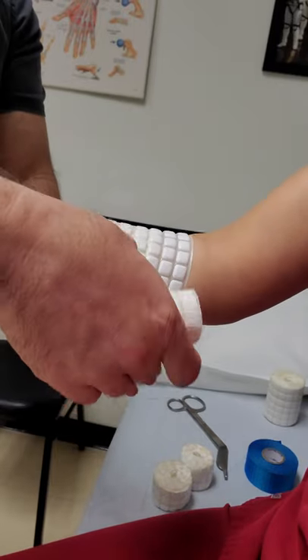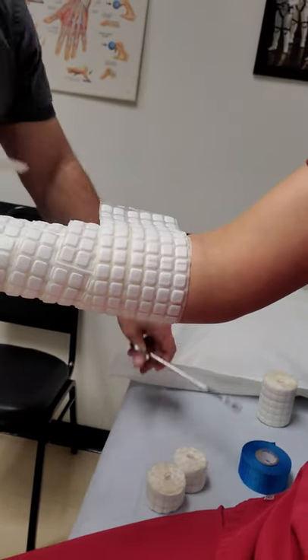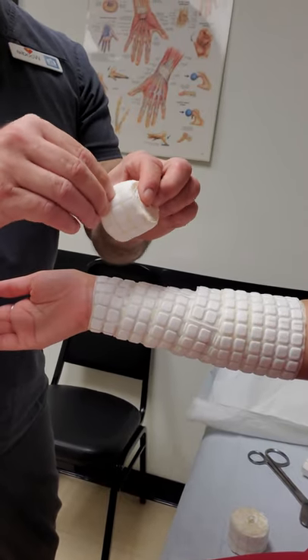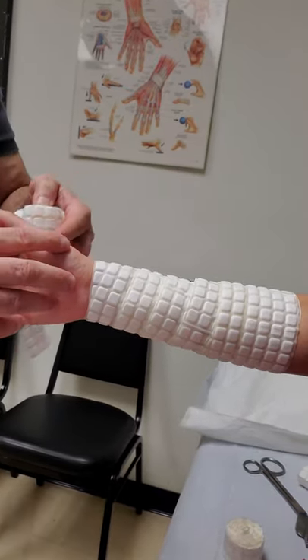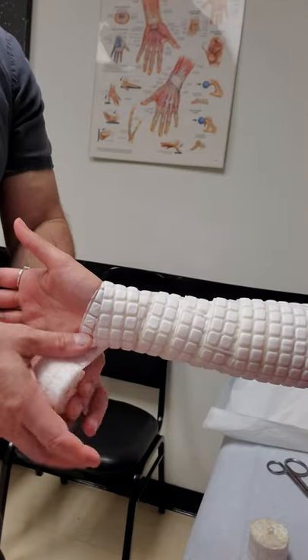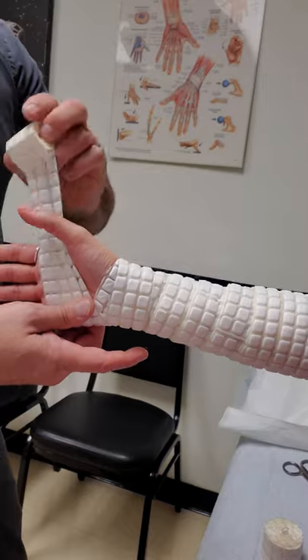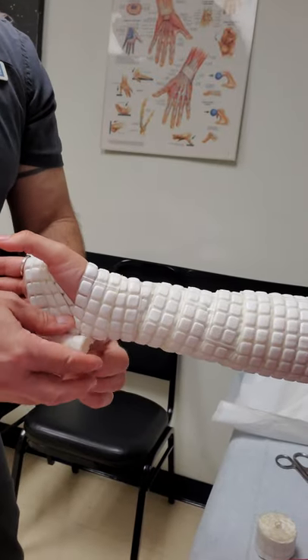Since it's a short arm, we'll stop here and trim that. I'll address the hand as well. On the hand, I've cut the roll in half so that we can work around the smaller parts of the hand a little bit easier. I'll have the patient turn their hand sideways and lift their thumb so we can maneuver on both sides of the thumb with the smaller piece. Then, like we do with cotton, we'll reinforce all of the edges.